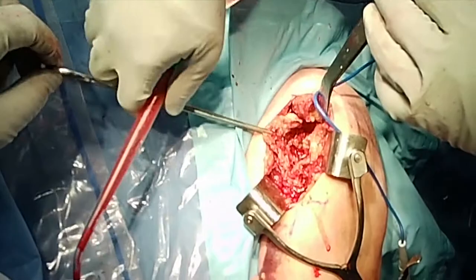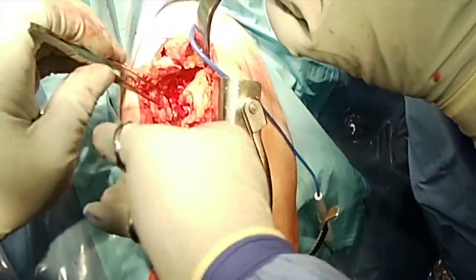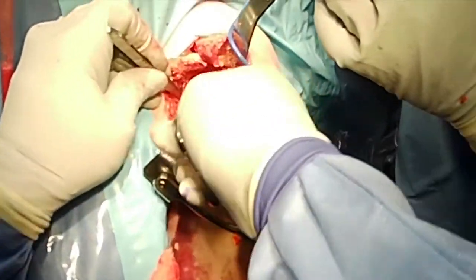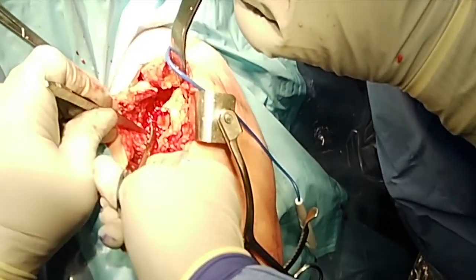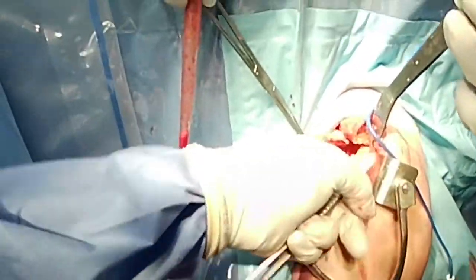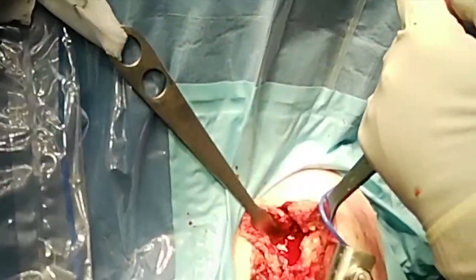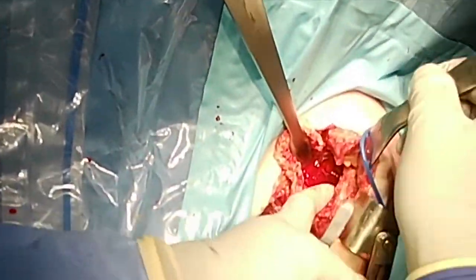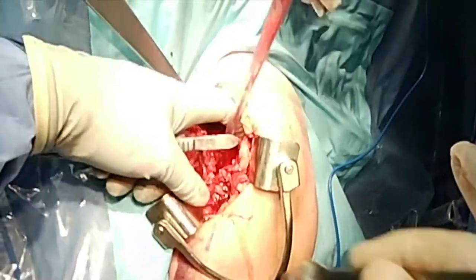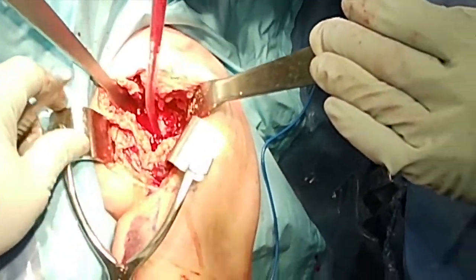Once the prosthesis is out, because there is a fracture it is fairly easy to identify the planes. You can see the other side of the glenoid, making sure that you release anteriorly. Now, because this is a revision situation, you need to be careful going inferiorly as the axillary nerve can be fairly close in the fibrotic and scar tissue. Place another one or two retractors in the posterior aspect of the glenoid to facilitate full exposure.